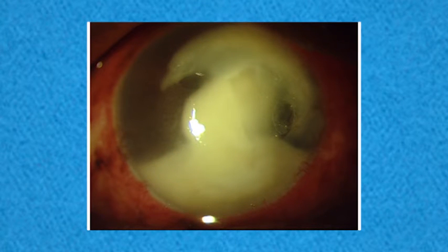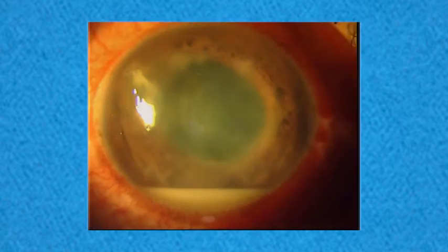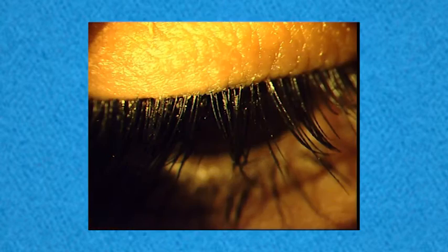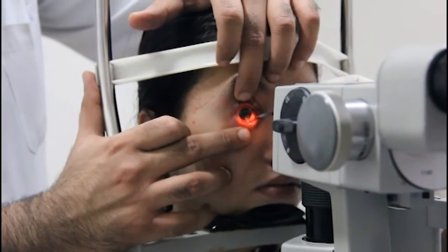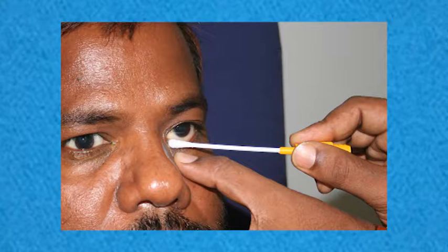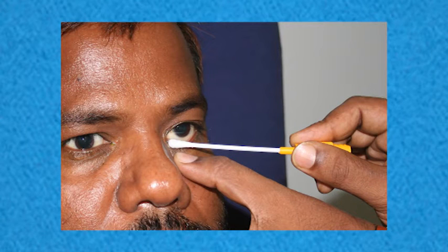Sample collection. Commonly, samples are collected in cases of infectious keratitis, endophthalmitis, conjunctivitis, blepharitis, and abscesses of the ocular adnexa. Corneal scraping is done in keratitis, conjunctival swab in conjunctivitis, pus in abscess, and vitreous sample is collected in cases of endophthalmitis.